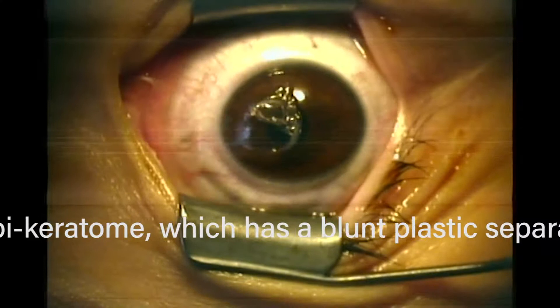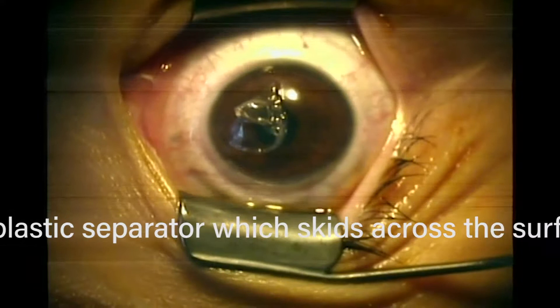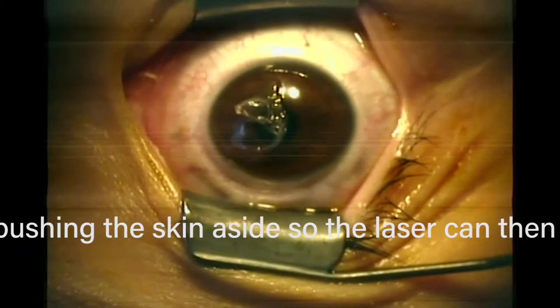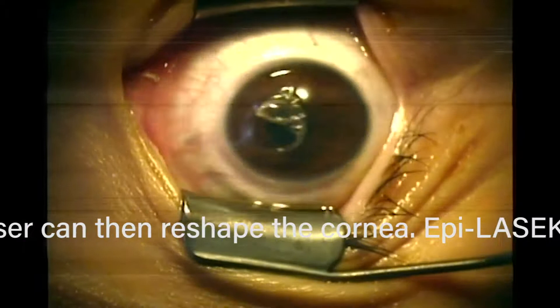This is a surface ablation, meaning the laser is applied to the surface of the eye. We just have to take the skin of the eye off; otherwise, some of the laser energy would be wasted evaporating the skin and you'd wind up with under-correction. So we take off the skin of the eye to access the cornea — the front clear window of the eye — and that's what we want to change the shape of with the laser.